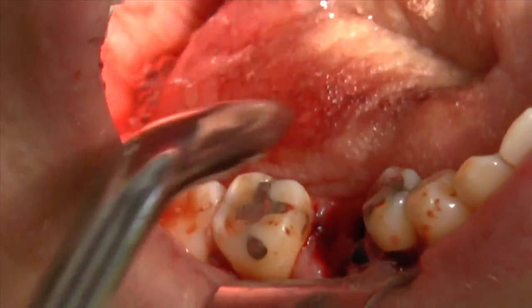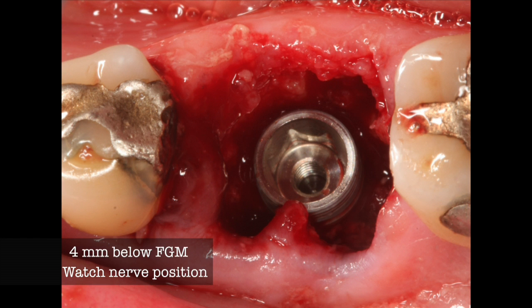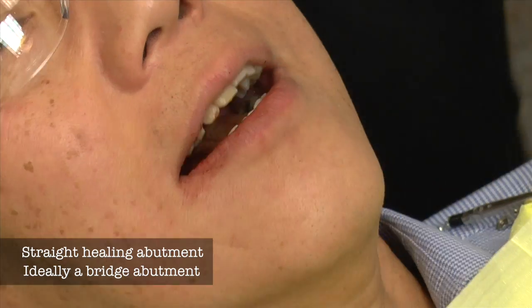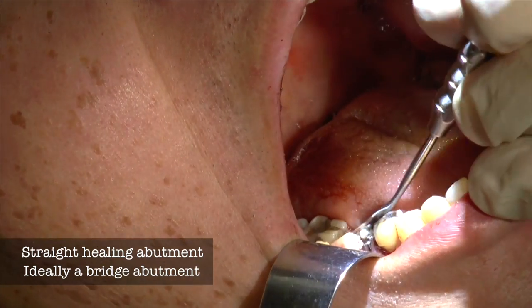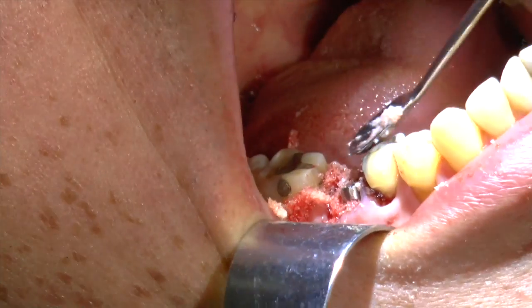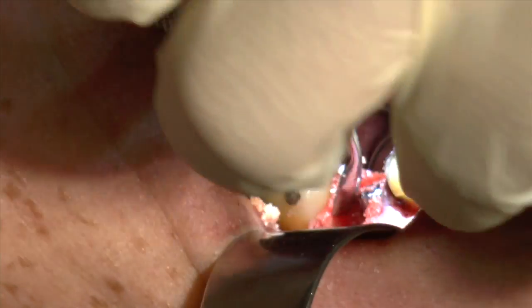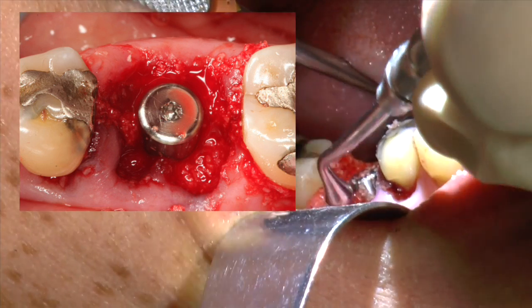We have the implant in position at about 70 newtons, at 4mm below the free gingival margin. We're watching nerve position — of course, you want to make sure you're not getting too close to the nerve. Now I'm going to place a healing abutment to do the bone grafting. I usually like to use a bridge healing abutment because it goes to the outside of the platform shift; we do not have one as this is a brand new setup and a test for this implant. You can see that we put the Creos bone in around the coronal aspect of the implant so that we can graft in the jump gap. By grafting in the jump gap, we're trying to control the soft tissues and have more bone grow around this implant so that we get bone growing to the top of where the platform shift is starting. By manipulating the bone, we get the blood into the bone, and this is going to allow it to heal nicely and we'll have a great, stable implant.